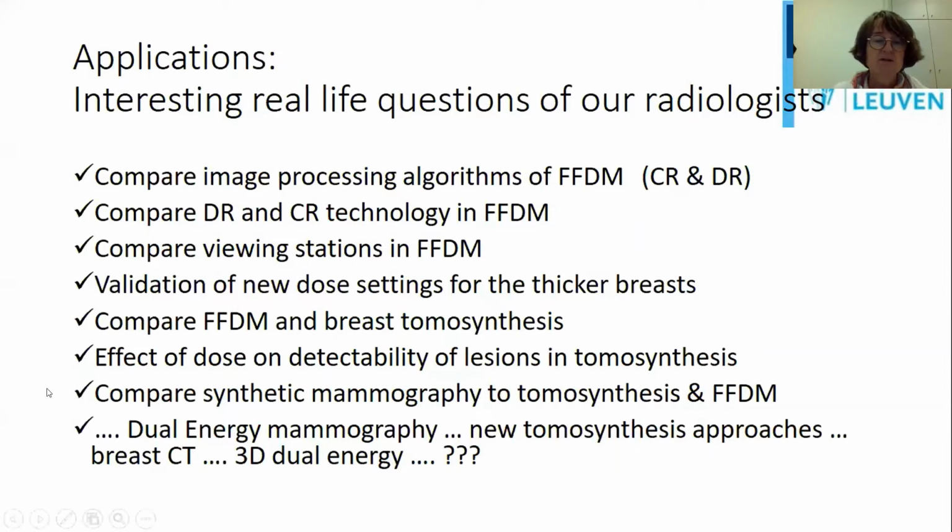Can we compare 2D mammography and breast tomosynthesis? Can we assess the effect of dose on detectability of calcs and masses in tomosynthesis? Can we compare or optimize the synthetic mammography versus FFDM? And there are many things to come: dual energy, new tomosynthesis approaches, breast CT, maybe 3D dual energy. I don't know. The future has not yet stopped. It will continue for a while.